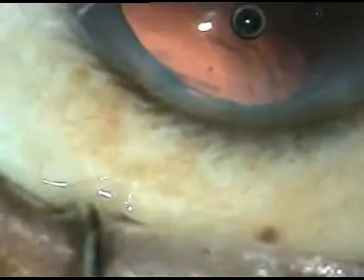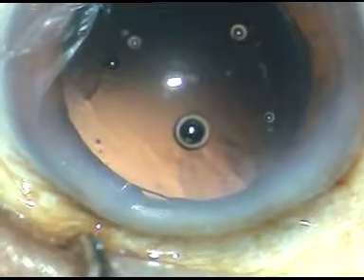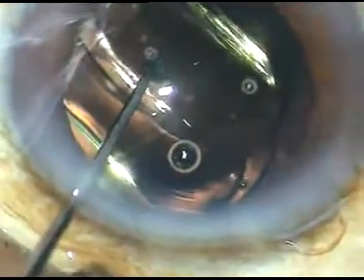Now it is placed on the injector. Now the piston is advanced and the lens goes towards the tip of the cartridge. In this case, I am enlarging the main incision a little bit by about 0.2 mm, and the incision size has become about 3 mm. This is for easy delivery of the intraocular lens without stretching of the main incision.